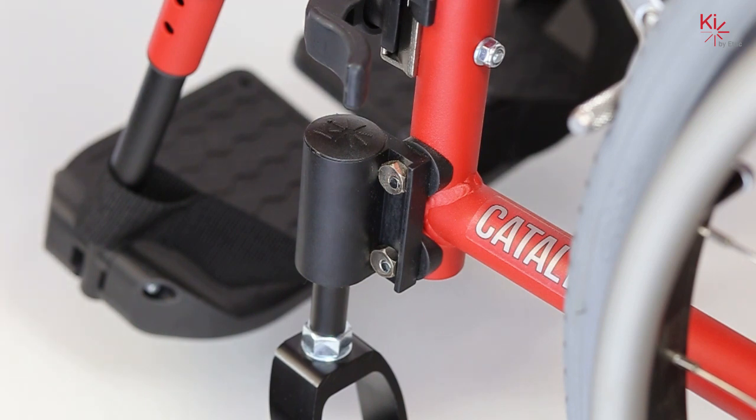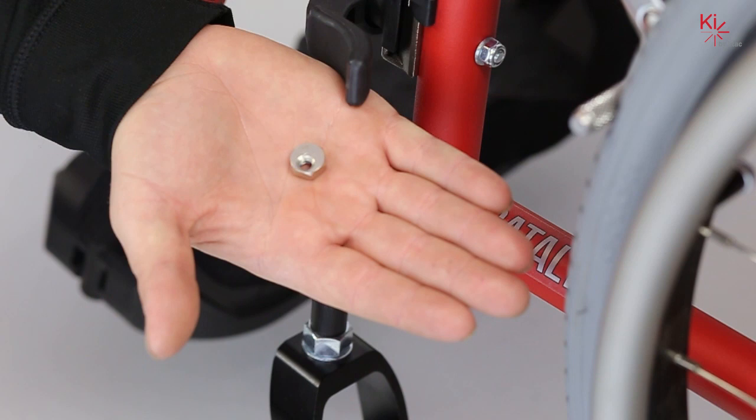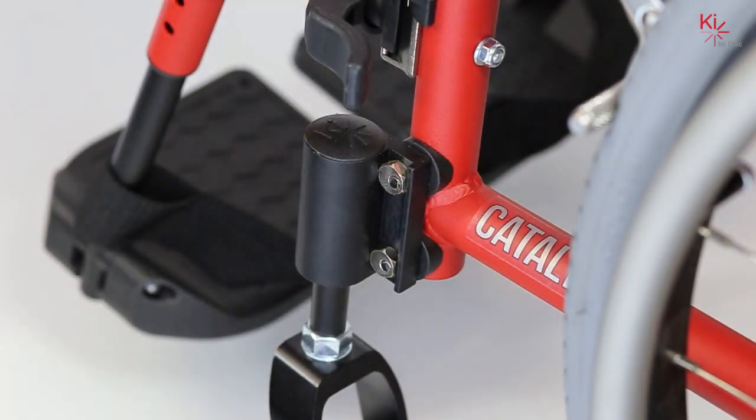The chair in this example was flat and we've adjusted the rear seat height to have one inch of dump. Please reference the chart located under the tools list for this video to determine how much adjustment of the eccentric nut is required. The eccentric nuts have six flat sides, and the adjustments are done referencing these sides.